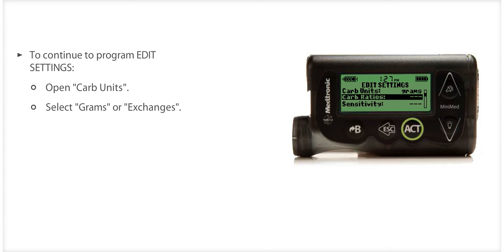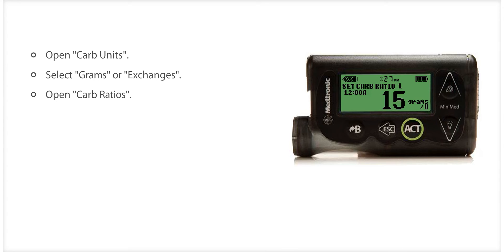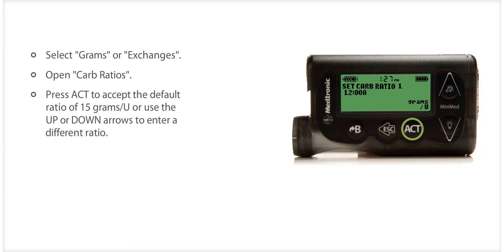Next, you will want to enter the insulin to carbohydrate ratio you want to use. On the Edit Settings screen, CARB Ratios is highlighted. Press ACT. You will see either Set CARB Ratio 1, if you selected grams, or Set Exchange Ratio 1, if you selected Exchanges. In this example, the Set CARB Ratio screen is displayed. Enter a practice setting for the CARB ratio, then press ACT.